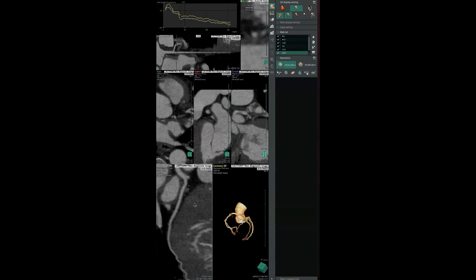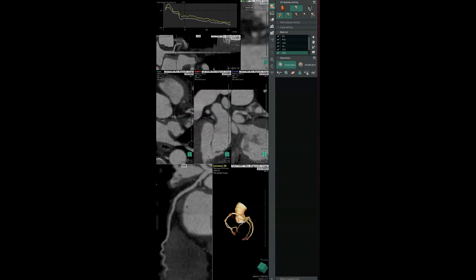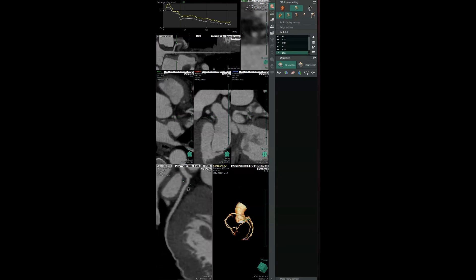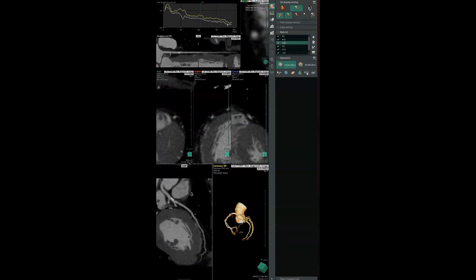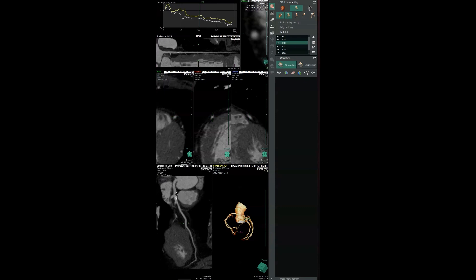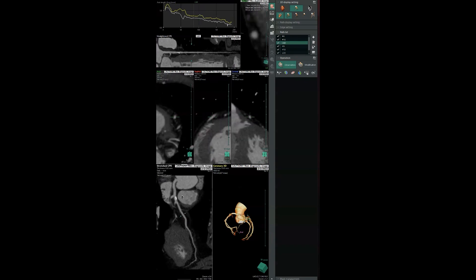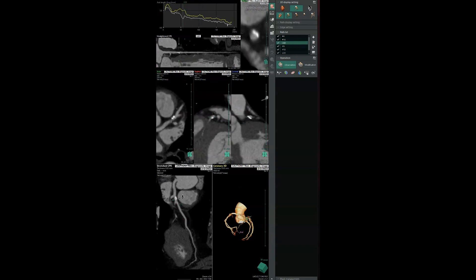We've taken the circumflex and stretched it out, so we have a stretched-out image and a more curved image. In our curved image, we can see that there is a small area of soft plaque that is showing up as dark, and this is resulting in minimal narrowing. If we switch vessels and go to the LAD, we can see that there's an area of bright plaque here, and when we evaluate it looking down the barrel, we can see this also resulting in minimal narrowing.